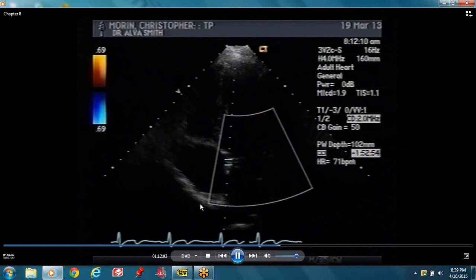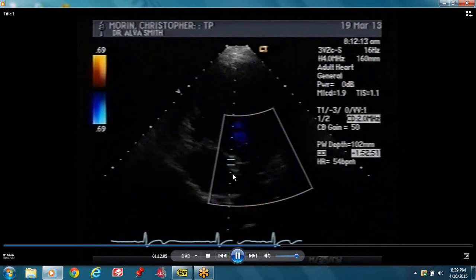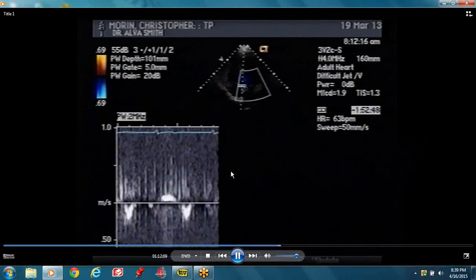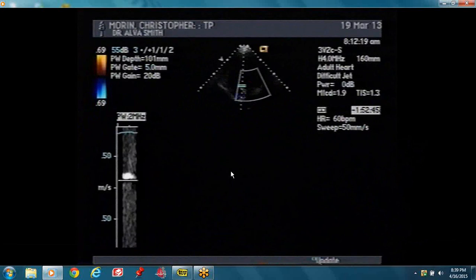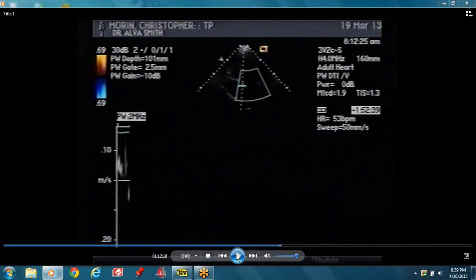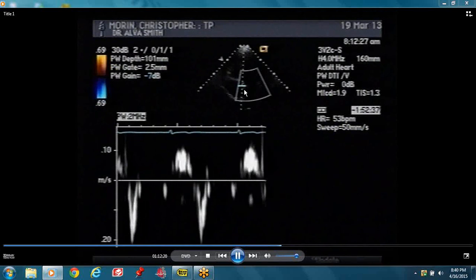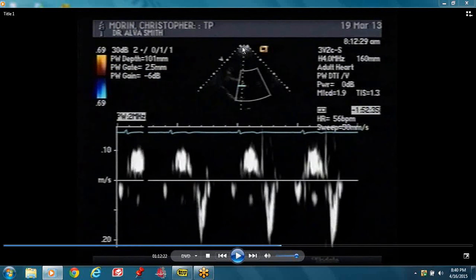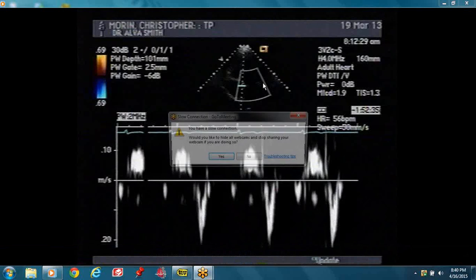Now we're evaluating the left ventricular outflow tract. This is your Tissue Doppler. Tissue Doppler is still using the pulse wave Doppler principle. The cursor is put at the mitral annulus — either the medial annulus or the lateral annulus — and you're looking for the velocity of the tissue.